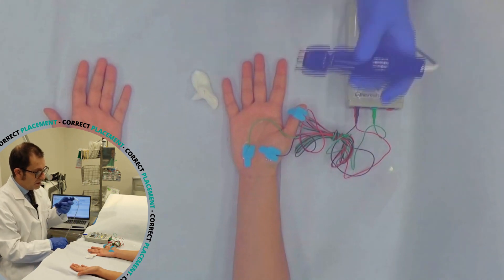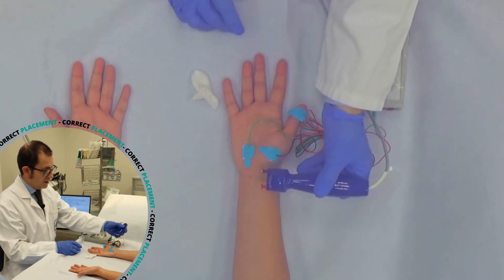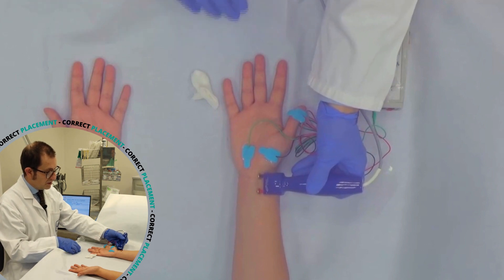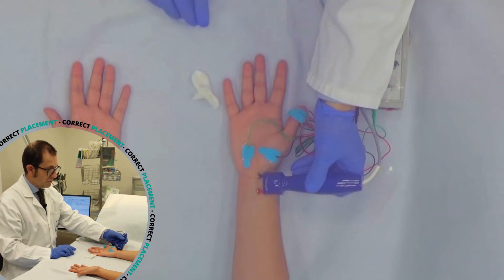In this way, I can show you that stimulating here at the wrist, we can record a motor response from the hand.